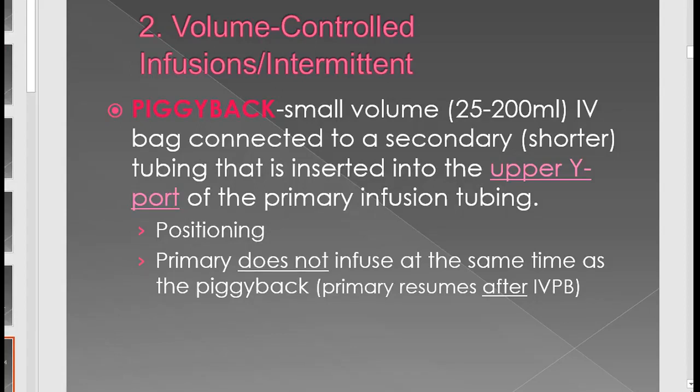One thing to remember is that the primary bag does not infuse at the same time as the piggyback does. What will happen is the piggyback will run, and then you will program your pump so that the primary bag will pick up right afterwards. Let's watch a video.